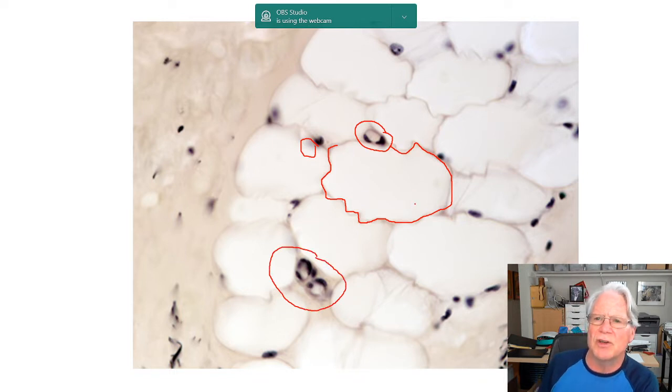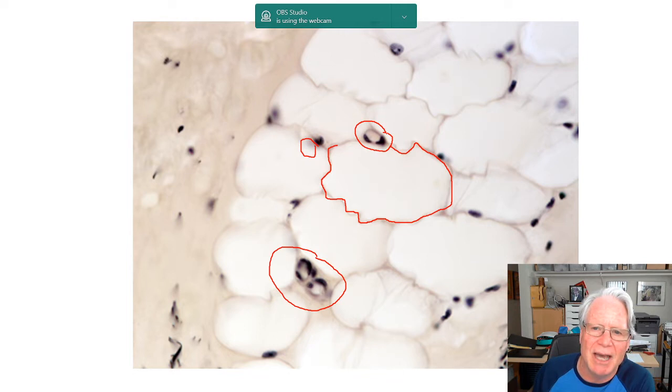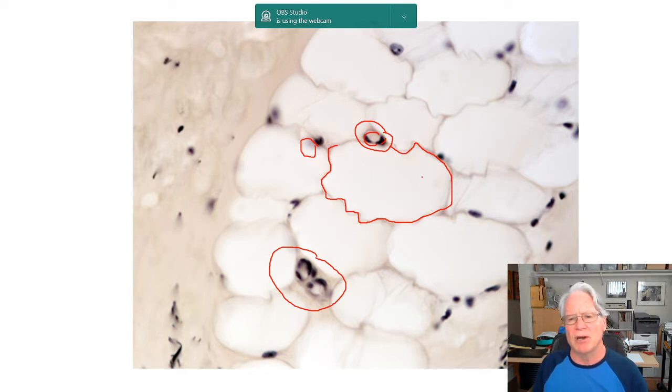So you're going to talk about, when you get into the circulatory system, you're going to have a whole chapter devoted to blood vessels. And you'll learn that there are arteries, arterioles, capillaries, venules, and veins. The arterioles are the smallest vessel leading into a capillary. And here you see a nice example. I'm sorry, this is the capillary. I apologize. So this is the capillary. What this is composed of is, in this case, two squamous cells forming a circle around that structure to create the capillary.